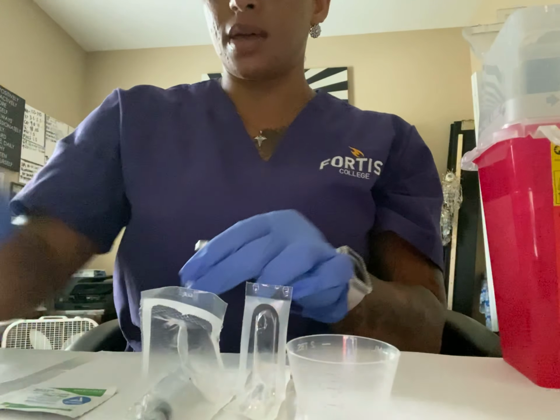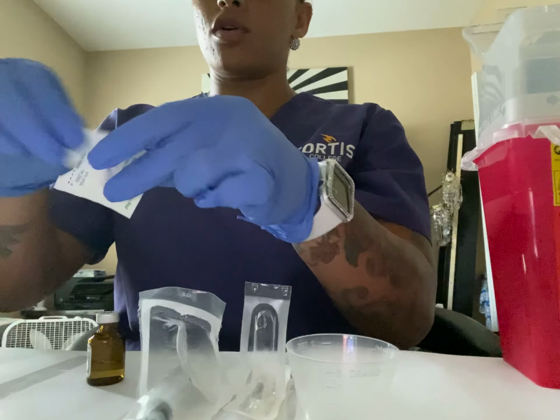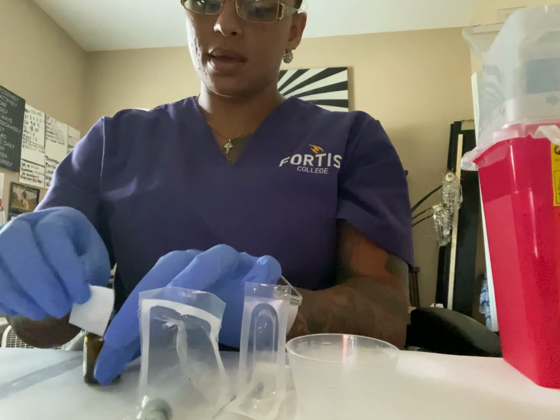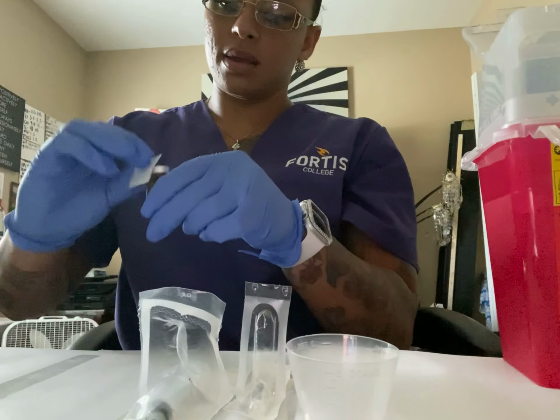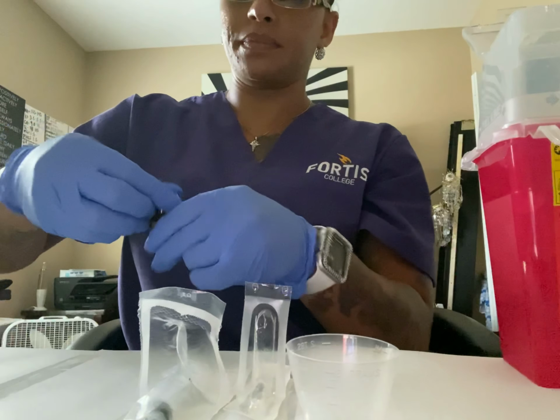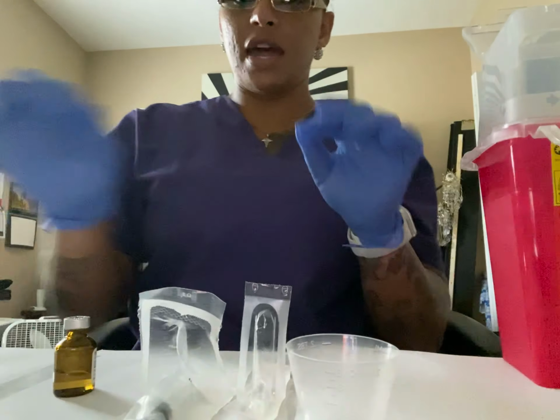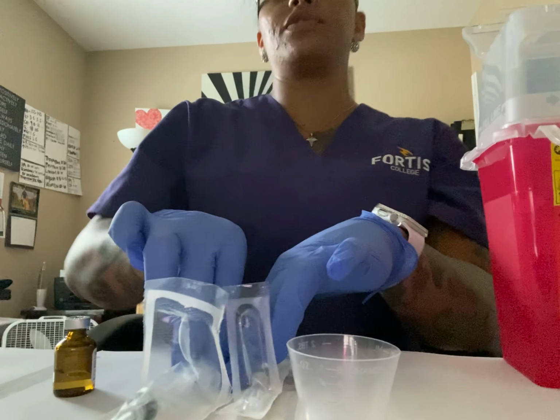Okay. I have my alcohol wipe here. I'm going to open the alcohol wipe and clean around the top of the vial. Okay. And then here I have my 5 milliliter syringe.